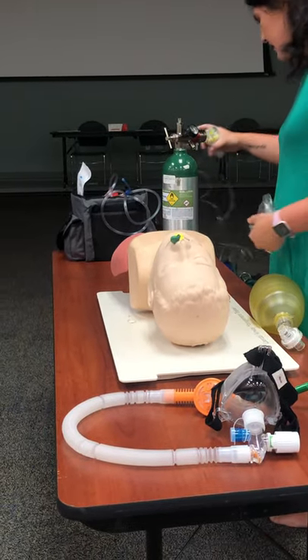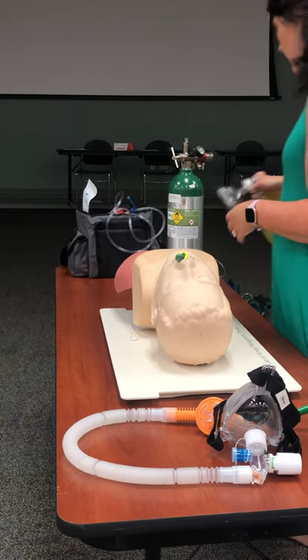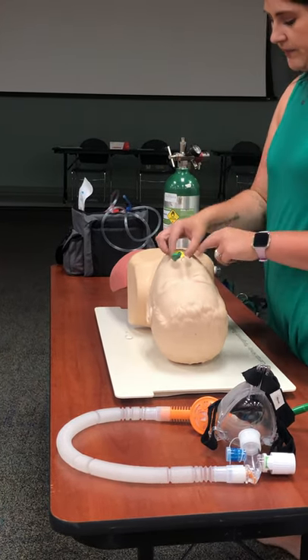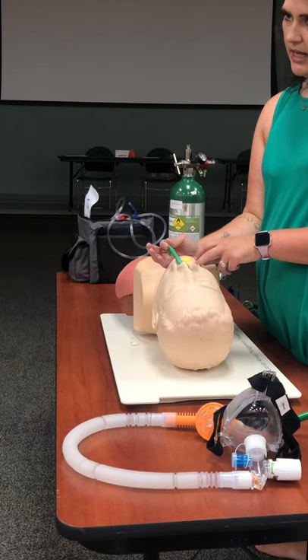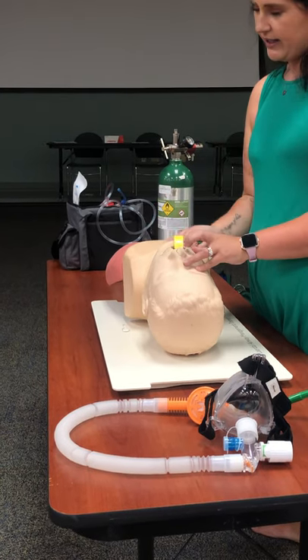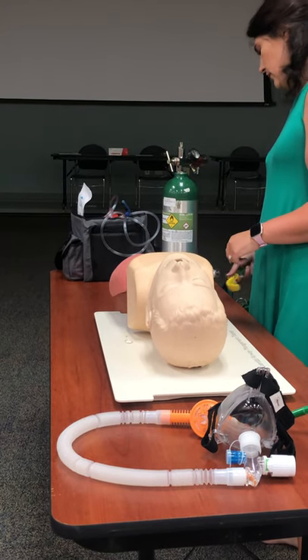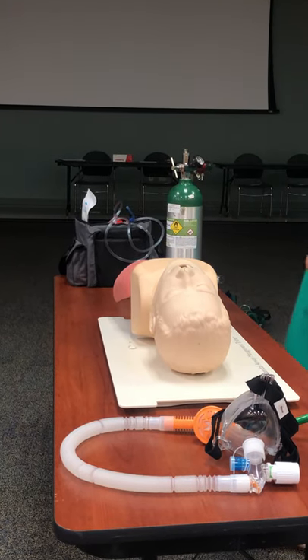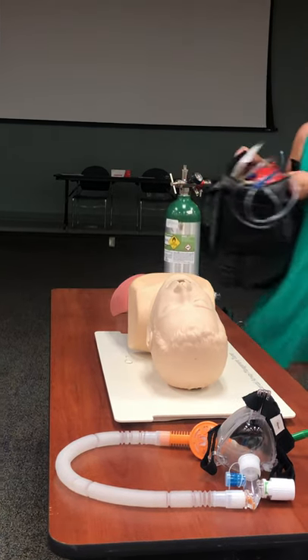To remove the NPA, pull it out following the curve of the face. To remove the OPA, pull it straight out and down, being careful not to stimulate his gag reflex. Now I'll show the suction equipment.